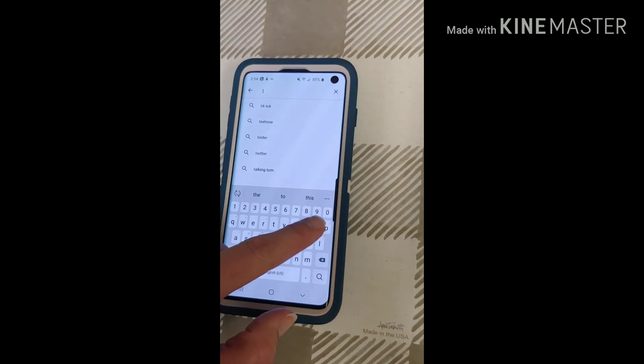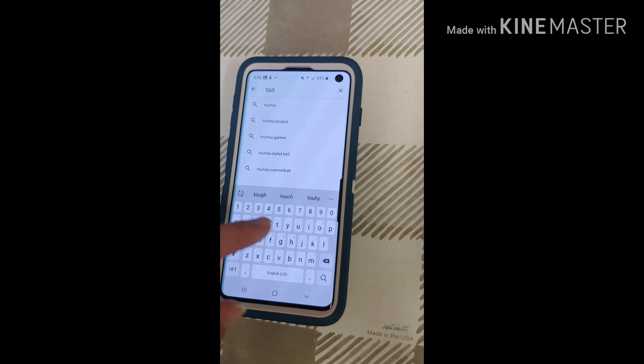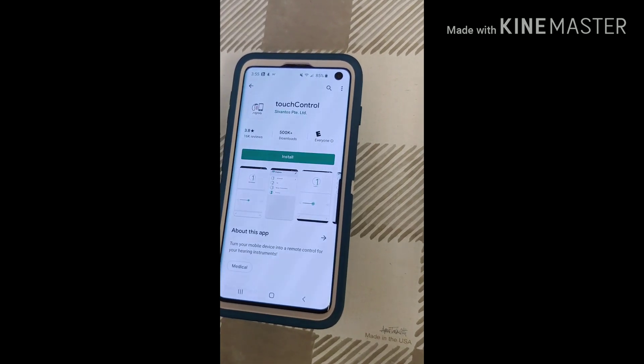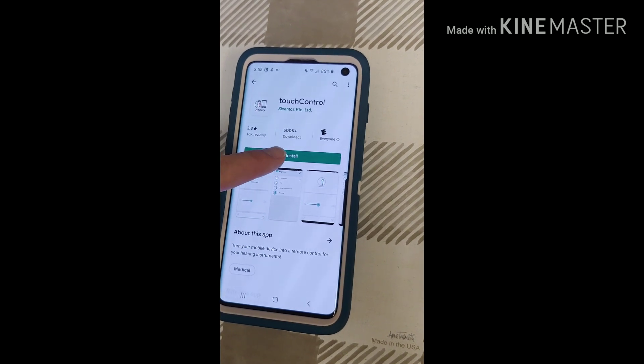You're going to search for what's called the Touch Control — it's all one word. Once you see it pop up there, you'll click on it and make sure that it is Signia. Then go ahead and hit Install.